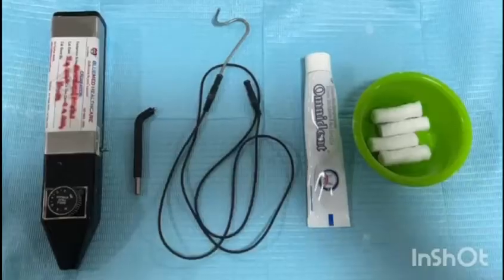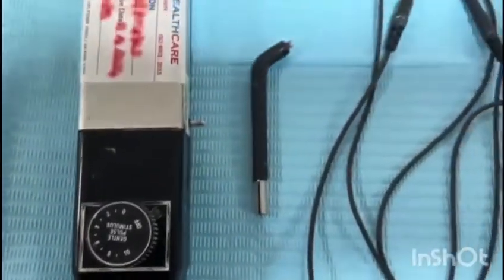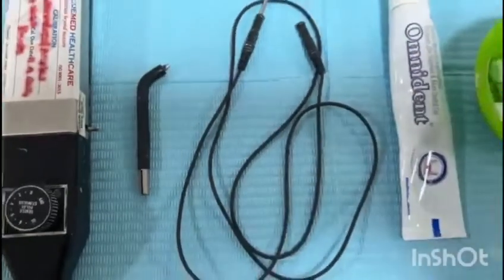Electric pulp testing is based on the principle of eliciting neural response in the pulp. It is a battery-operated device which is connected to a probe that is applied on the tooth to be tested.